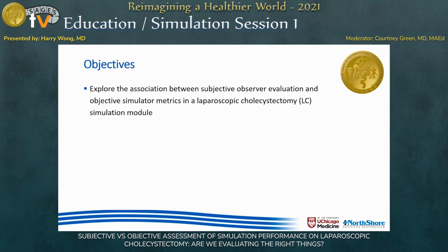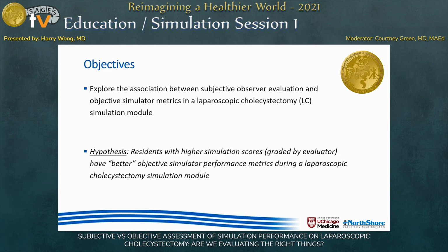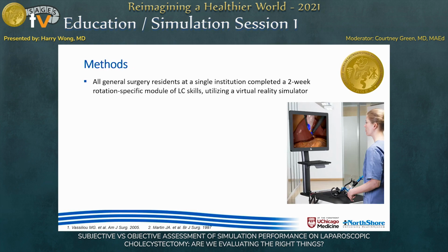So we wanted to explore the association between subjective observer evaluation and objective simulator metrics in a lap chole simulation module. We hypothesized that residents with higher simulation scores have better objective simulator performance metrics during a lap chole simulation module. To do this, we collected data from all general surgery residents who completed a 2-week rotation-specific lap chole simulation module utilizing a virtual reality simulator. Their performance was evaluated by pre- and post-test at the beginning and the end of the rotation.